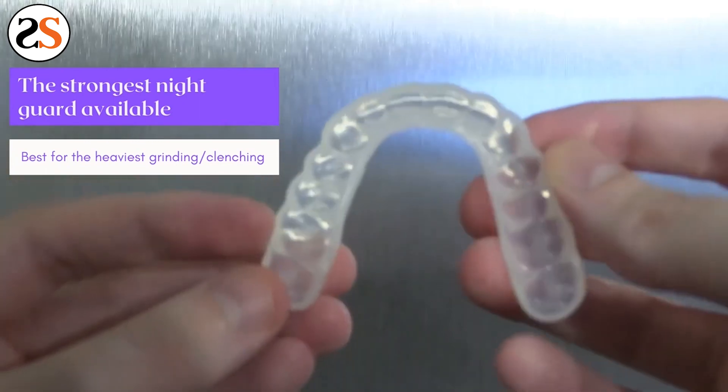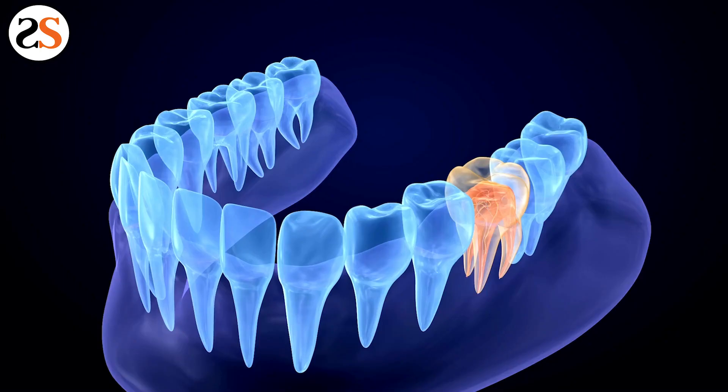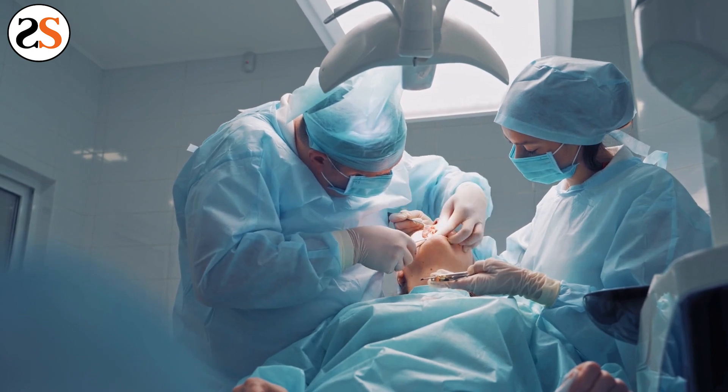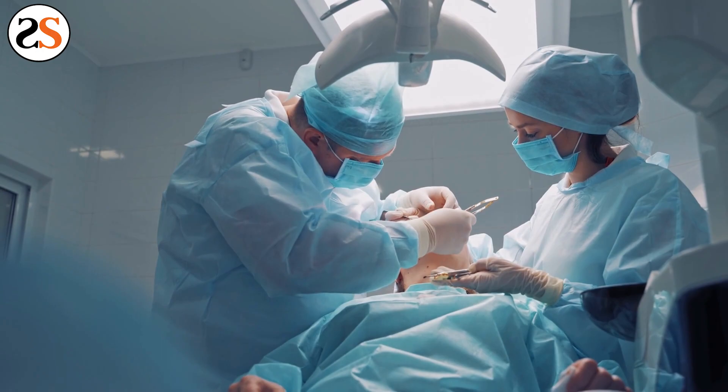So where can you get a bite splint? Your dentist may suggest that you purchase a teeth grinding guard after inspecting your teeth. If your teeth are starting to wear down, the nerves for your teeth may begin to become exposed, making your teeth sensitive to hot or cold foods or giving them a general pain throughout the day.